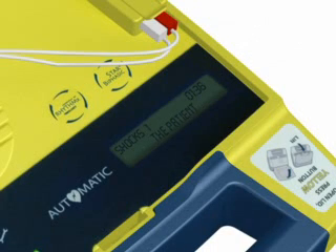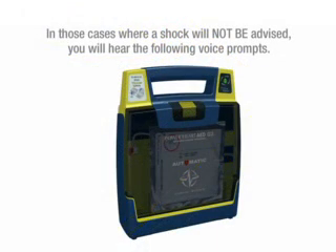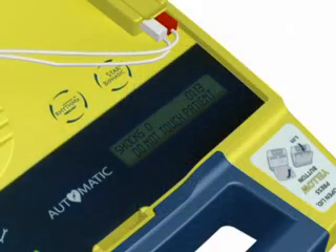It is now safe to touch the patient. Do not touch patient. Analyzing heart rhythm. Please wait. It is now safe to touch the patient.